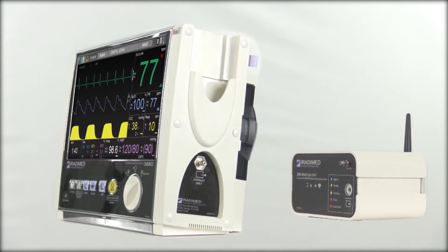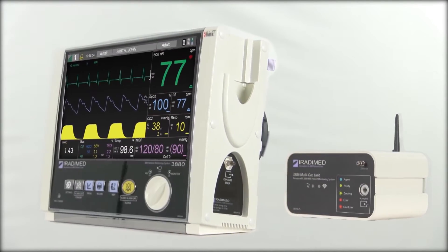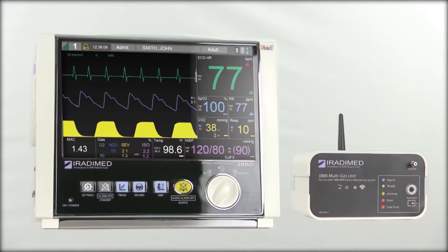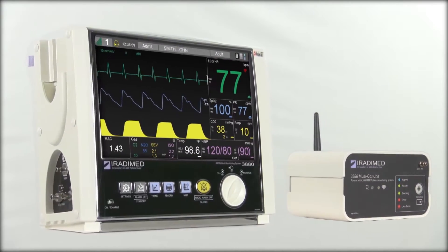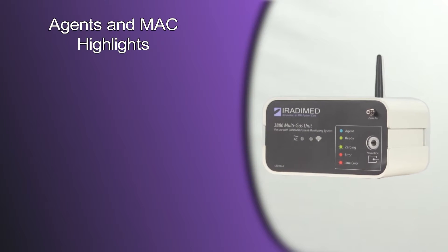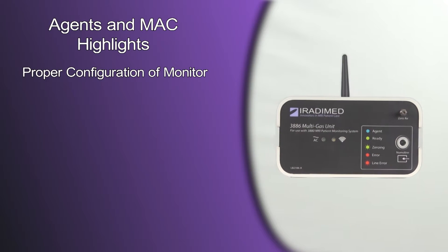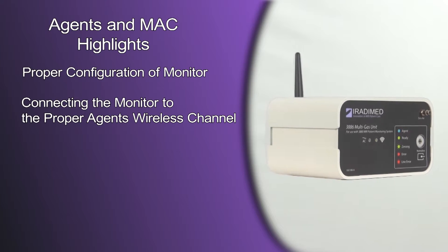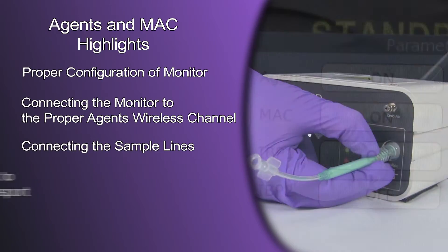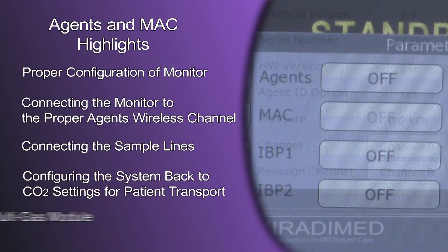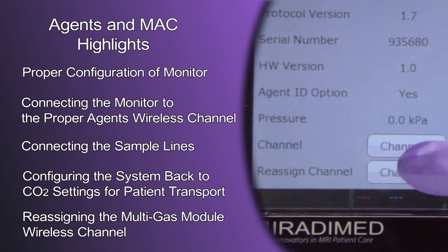Today we are going to review the essential steps for the preparation and application of the wireless 3886 multi-gas module for the 3880 MRI patient monitor system. We will focus on proper configuration of the monitor, configuring the monitor to the proper agent's wireless channel, connecting the sample lines, configuring the system back to CO2 settings for patient transport, and finally reassigning the multi-gas module wireless channel.